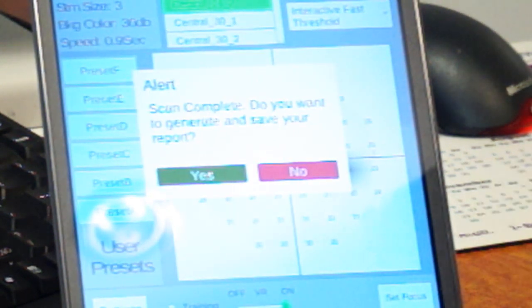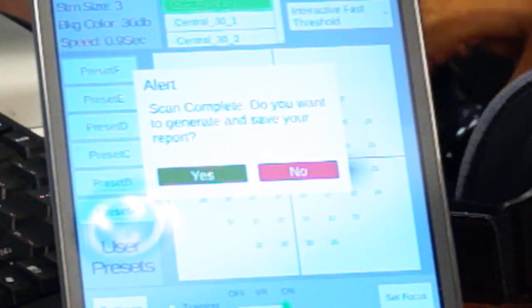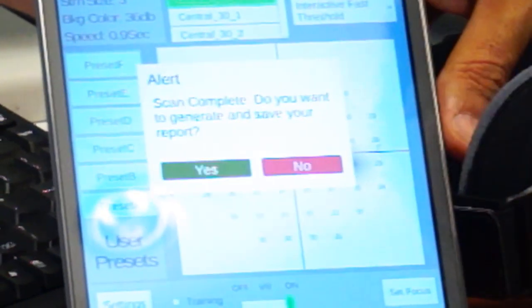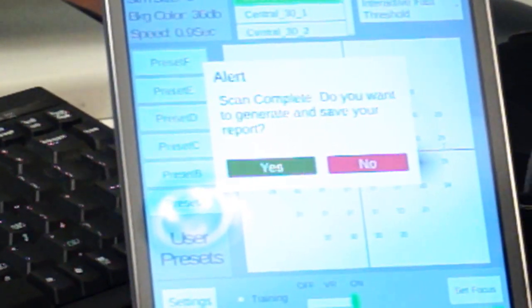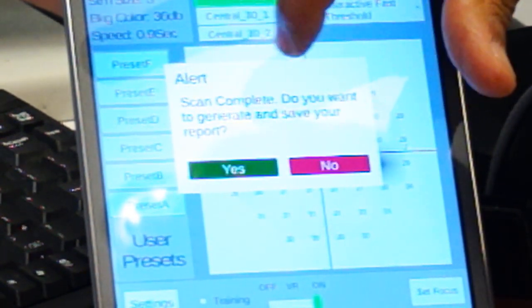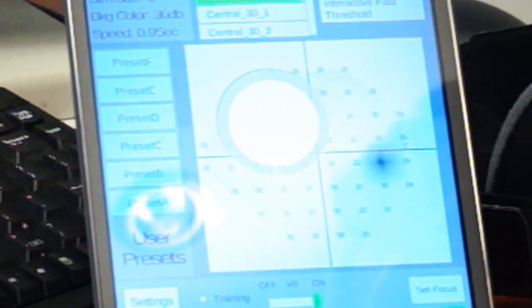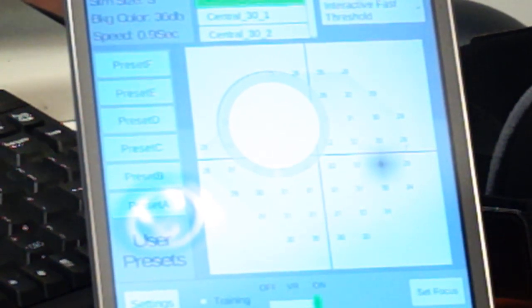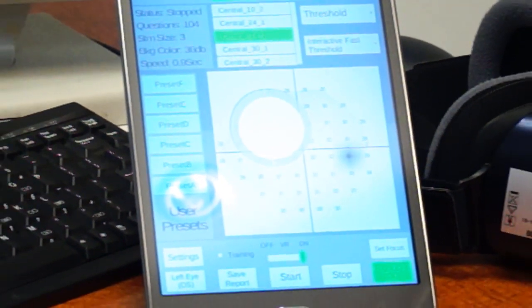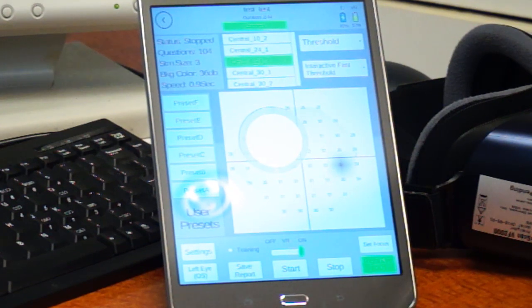Here I am done. The controller has received the data and is asking: scan completed — do you want to generate and save your report? Yes. A PDF report is now being generated, and once generated, if you are connected to the internet, it will be sent via the internet to your account where you'll be able to see the report.